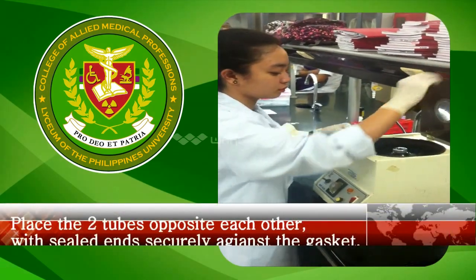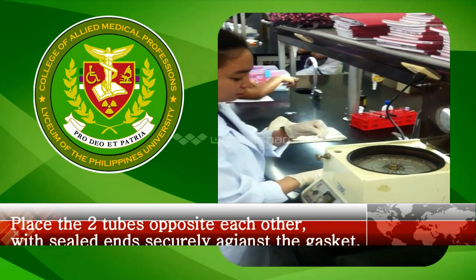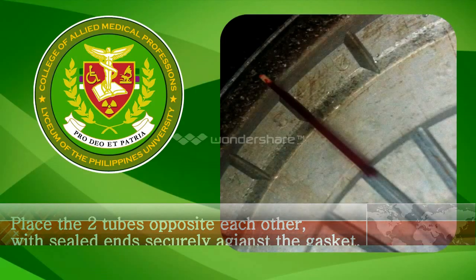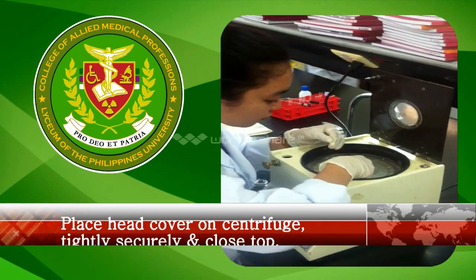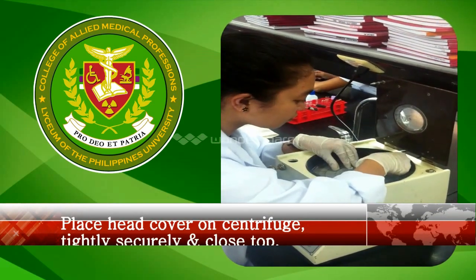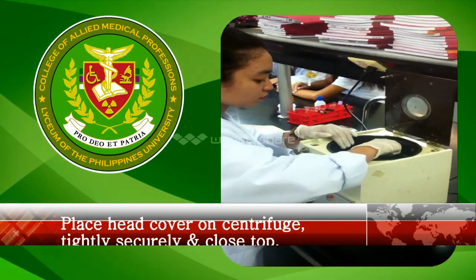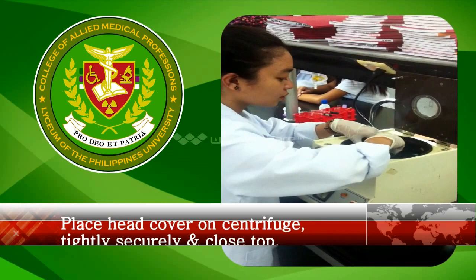Place the 2 tubes in the radial grooves of the microhematocrit centrifuge head exactly opposite each other with sealed ends securely against the gasket. The capillary tube should be sealed securely because incomplete sealing of the capillary tubes will give falsely low results in the process of spinning, because RBCs and a small amount of plasma will be forced from the tube.